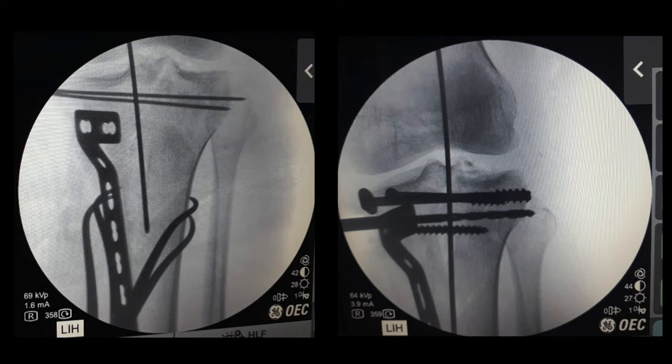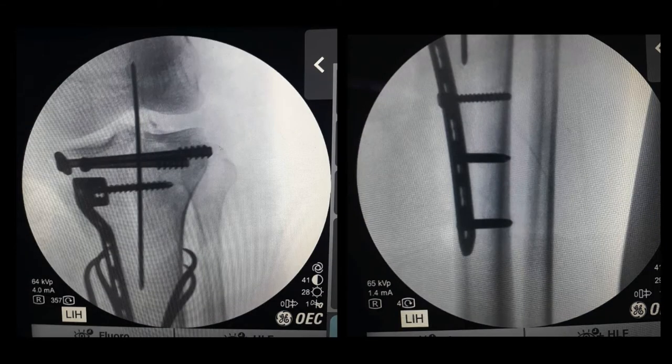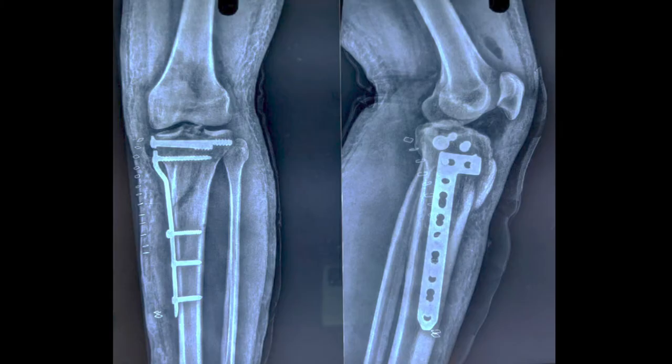There are the intraoperative fluoroscopic images. We went for the posteromedial incision, reduced with tenaculum, and fixed provisionally with K-wires. We decided to fix the fracture further with lag screws. We didn't chase further after the depression because it looked okay on the fluoroscopic views intraoperatively. You can't really assess the depression without actually opening the lateral side. There's the buttress plate — two lag screws with a buttress plate on the medial side. We were very confident with the tibial tuberosity because intraoperatively it was stable — not coming off — so we didn't fix that tibial tuberosity fracture.